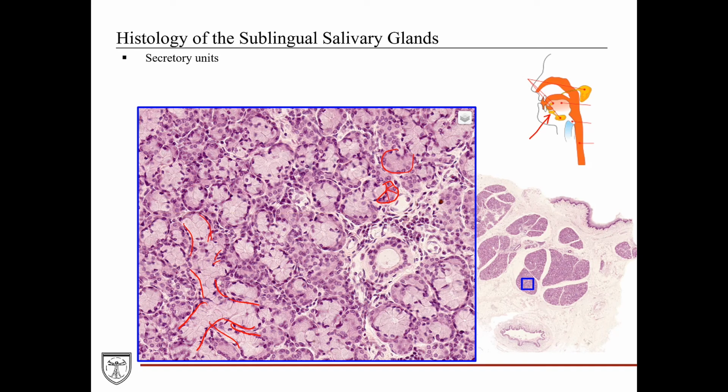So this type of histology indicates that again, sublingual salivary glands are a mixed type of gland in that they have tubuloacini and acini, but the tubuloacini far outnumber the acinar composition, which then indicates that the secretory products of the sublingual salivary glands would be mostly mucin, but it would also have some watery fluids with amylase and antibodies.